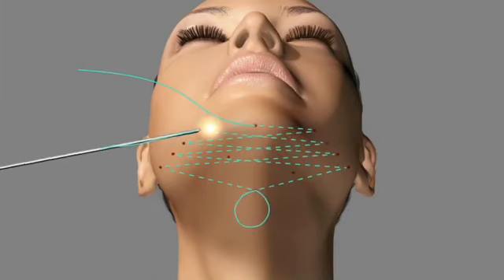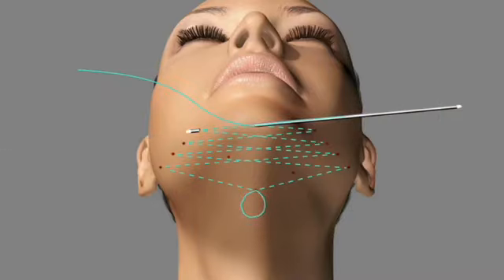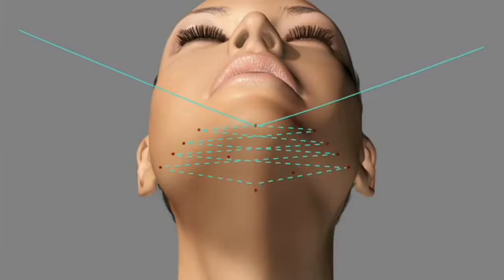If the surgeon does not do this and reaches the end of the operation with a loop of suture out of the submental incision, it is almost impossible to tighten it at this time, secondary to the braided nature of the suture and the weaving around several ligamentous attachments. Upon completion, the two ends of the suture are tightened, the suture rods are cut free. The assistant puts gentle upward pressure in the submandibular area, thus helping to place tension on the suture matrix.